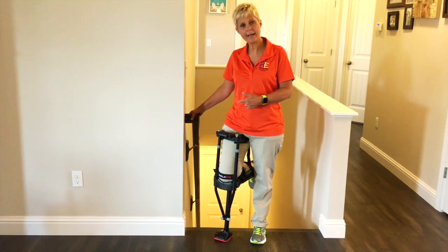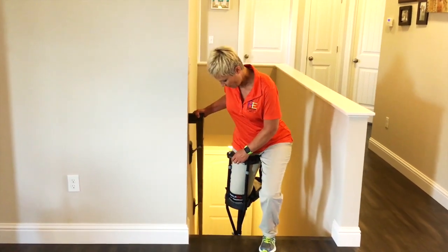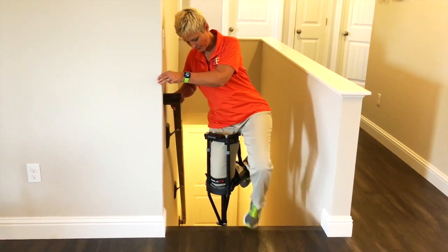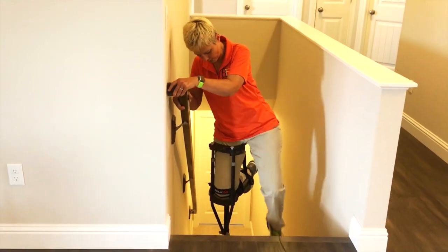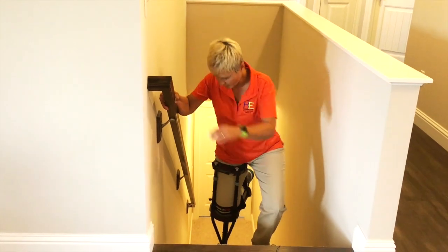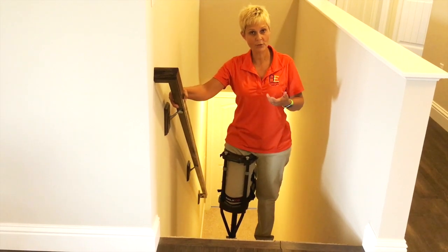You're going to lead down with the foot or the leg that has the iWalk on it first. So you're going to step back with the iWalk, okay? And then you're going to hold to the rail and you're going to step down with your good foot. Then you're going to step down again with the iWalk, hold to the rail securely and step down with your good foot. One more time, step down with the iWalk, hold to the rail and step down with your good foot.